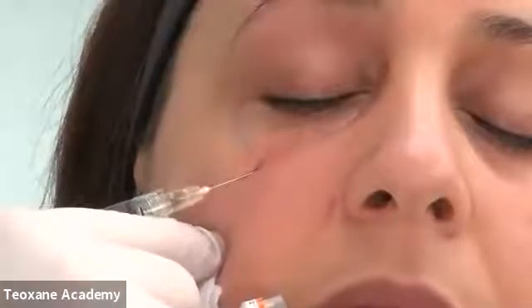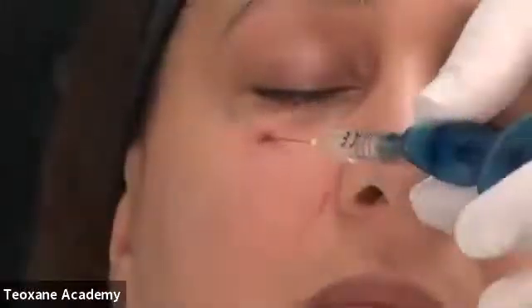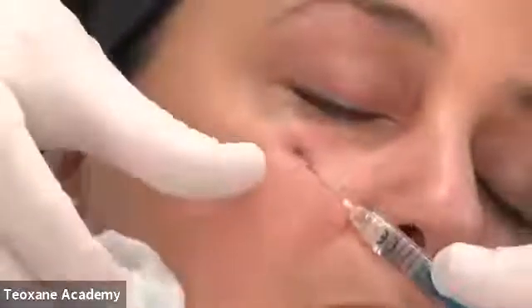So to do the palpebral malar groove, I will need to go on the other axis, to turn my cannula, stay deep like this, and go on the other side. So I will go on the other side of my patient. I turn around. I ask my patient to turn the head a little bit to me, and I will go on the lateral side.